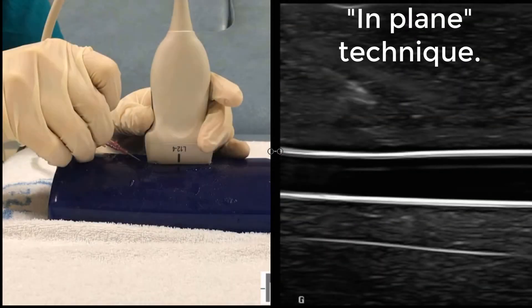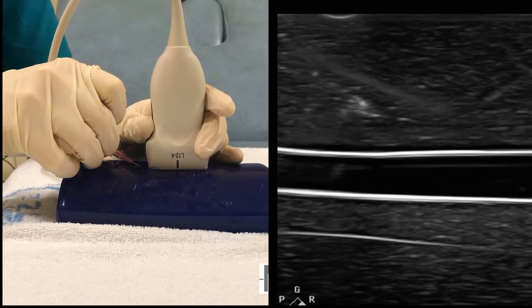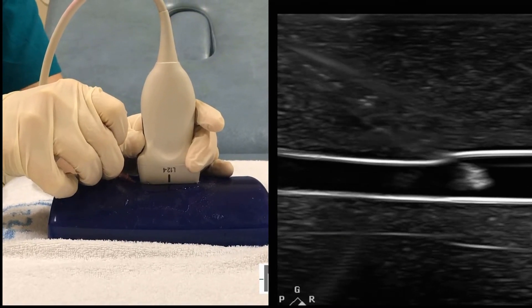Now the in-plane technique — this can be quite challenging in small veins. It's quite easy to slide off the vein with the ultrasound probe. Once you have that vein in long axis, don't move the probe. Again we can easily see the cannula approaching the vein, indenting the wall and entering the vein. And there is the cannula being threaded in. Success.